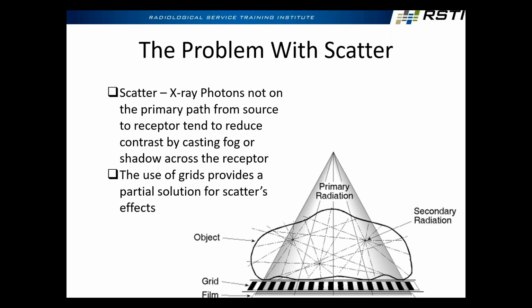They came in different ratios, basically how tall the strips were. That would affect the distances that you could use them at, or their focal range, but they work. The other thing that they did was they figured out, hey, if we move that grid during the exposure, it'll blur those grid lines and they'll disappear. And then later on, when they got into digital imaging, they said, hey, we've got computers, so if it sees grid lines, we can say, make them go away. And it does. And then some digital receptor manufacturers like Philips said, yeah, that's a bit much, so we're still going to use the moving grid because it's easier. There's less things to go wrong.